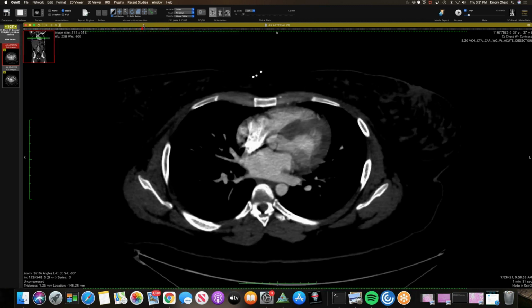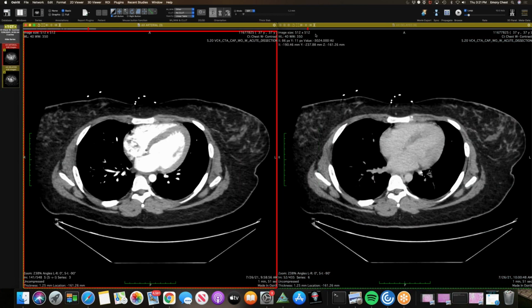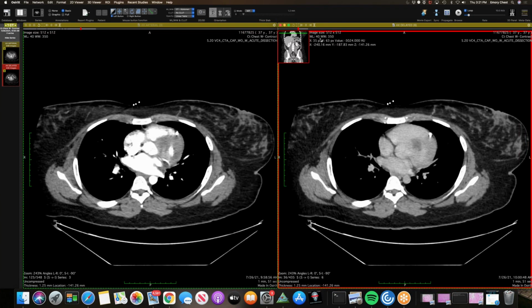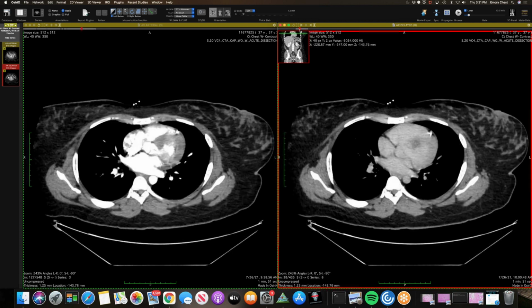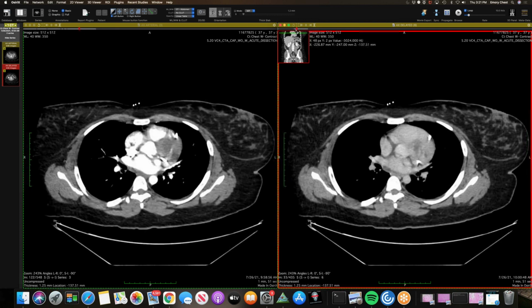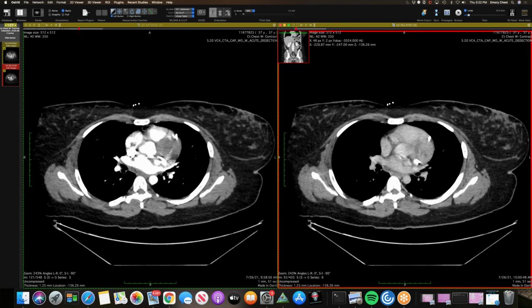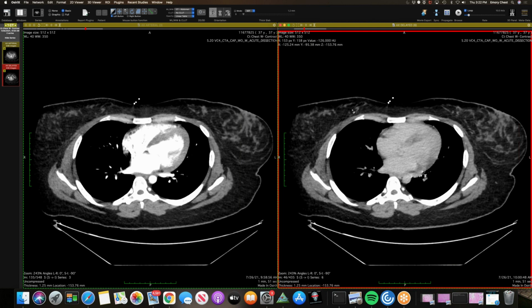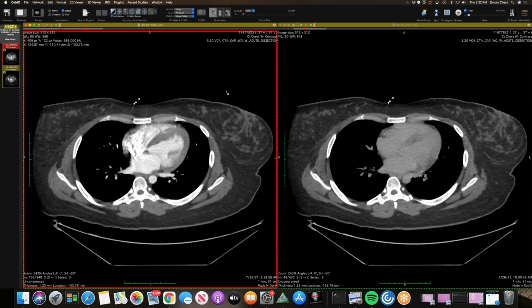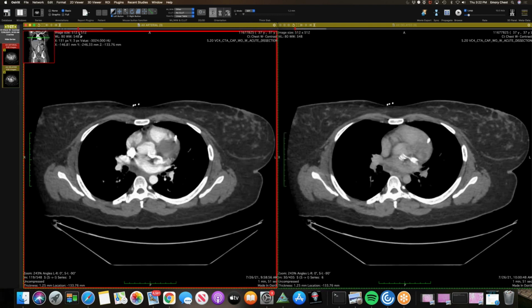We didn't see any fibromuscular dysplasia, but this is the arterial phase, and I'll pull up the delayed. It was just a nice example of where you can see the infarction on the delayed phase. You can see the hypoperfused myocardium in the septum, and a little bit in the free wall. It's cool. It's kind of happenstance getting the delayed scan. I don't really appreciate it on the arterial phase, on the earlier phase, and then on the delayed you can see the hypoperfusion.